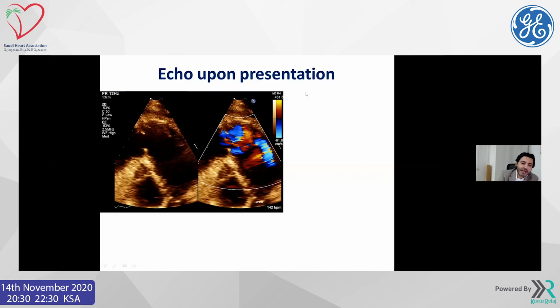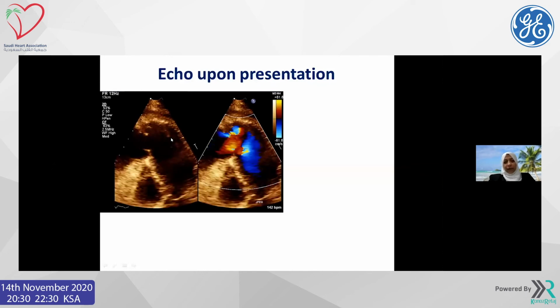And also, if you track the wall, the LV wall and all that muscle layer, you will not see it in the defect because it will be covered by pericardium only, not part of the muscle. So it will be loss of the intima itself. There is no myocardium, and there is only the pericardium outside. And you will have a small neck and a large cavity.